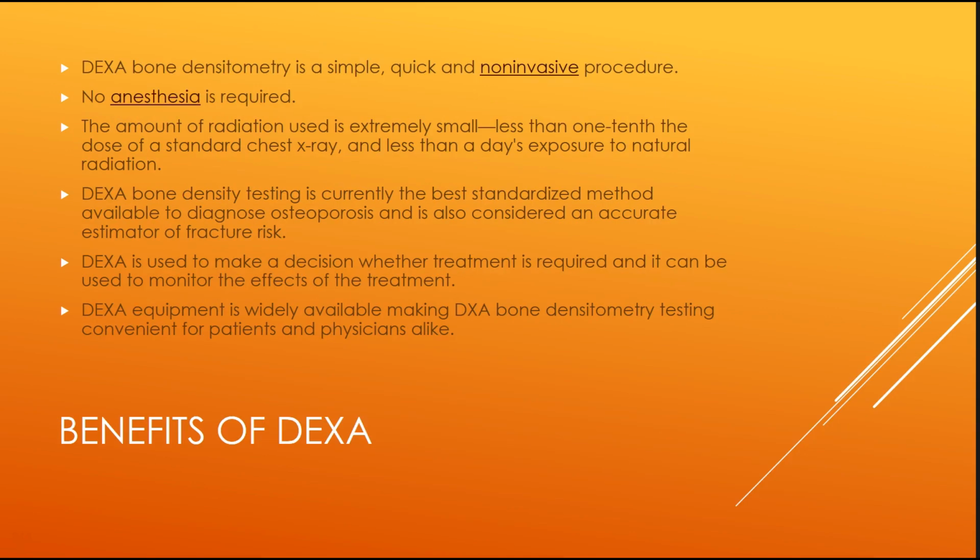Okay, so the benefits of Dexa. Dexa bone densitometry is a simple, quick, and non-invasive procedure. No anesthesia is required. The amount of radiation used is extremely small. It says here less than 1/10 the dose of a standard chest x-ray and less than a day's exposure to natural radiation. We know that not to be true.